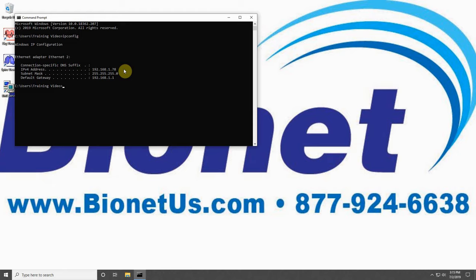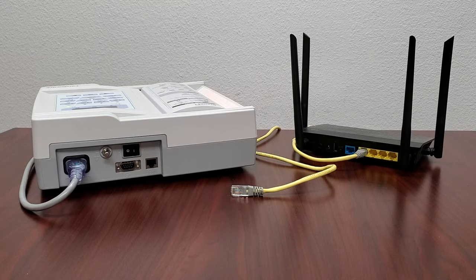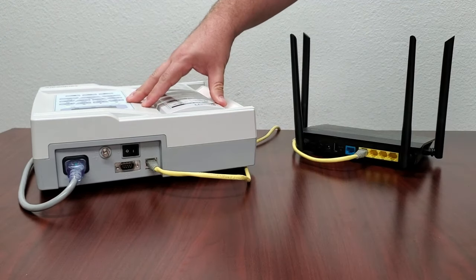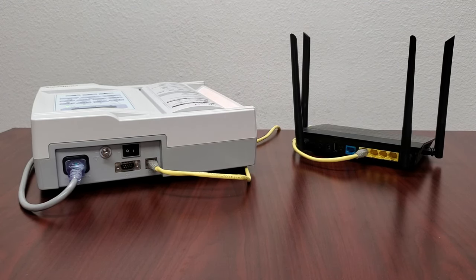Let's begin by going over the steps to connect the CardioCare 2000 to BMS Plus. First, connect your CardioCare 2000 to your internet router using an Ethernet cable. Ensure that the router you use is the same one providing a network connection to your computer with BMS Plus, as they will both need to be on the same network to communicate.